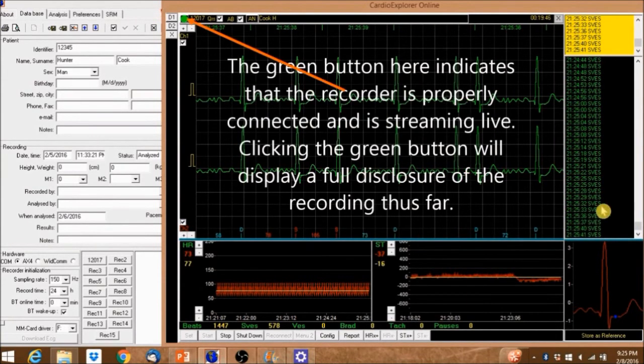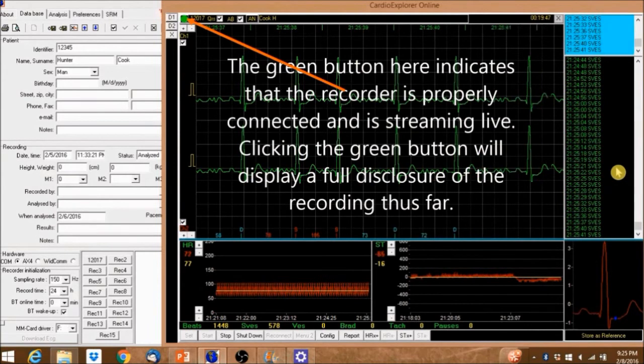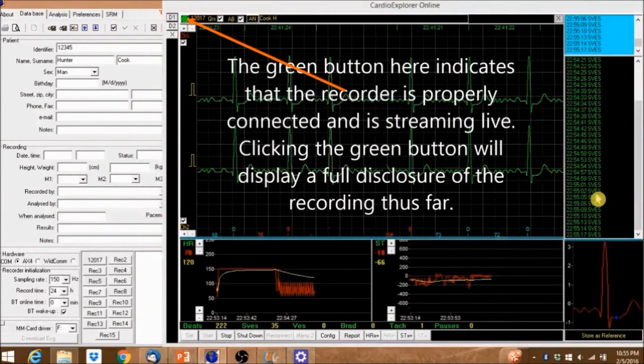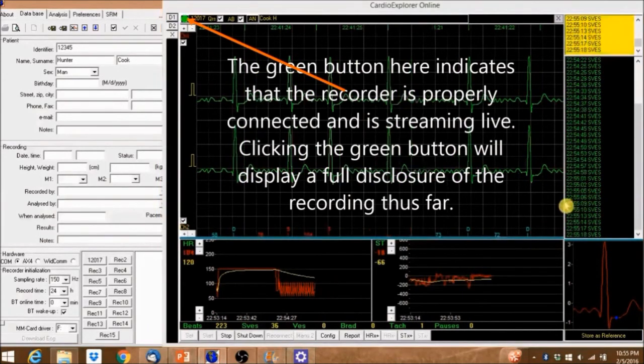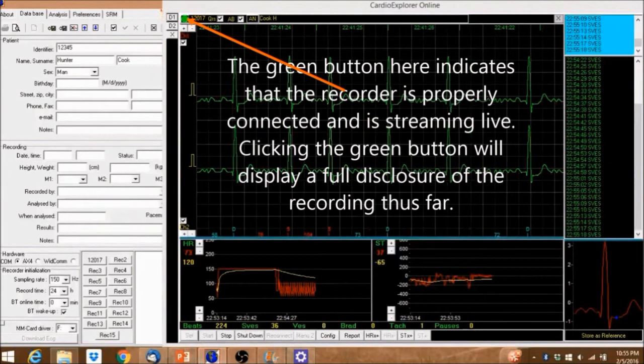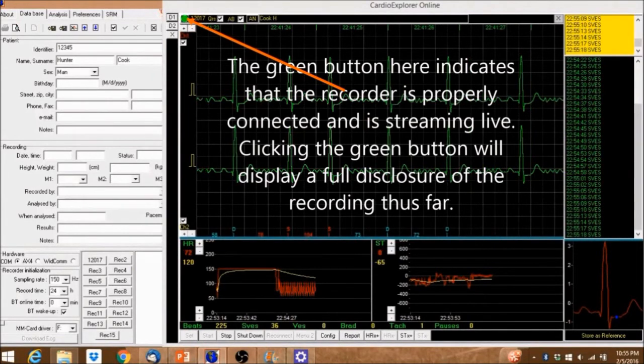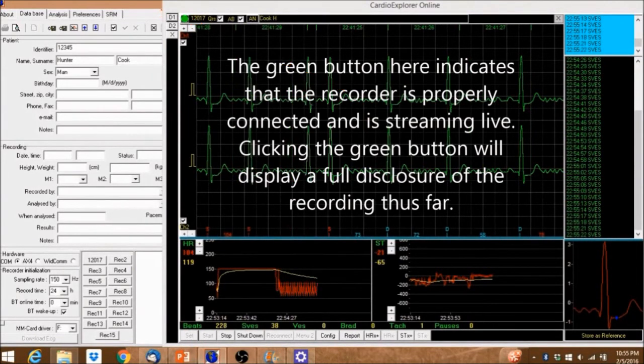The green button here indicates that the recorder is properly connected and is streaming live. Clicking the green button will display a full disclosure of the recording thus far.